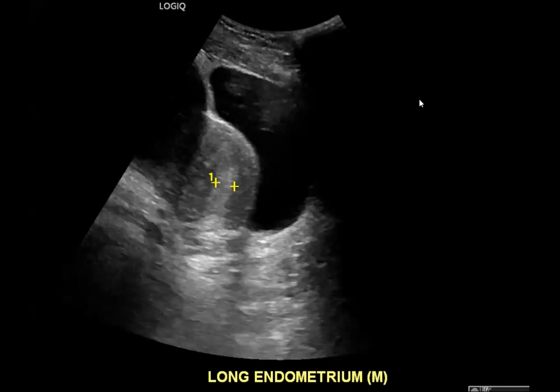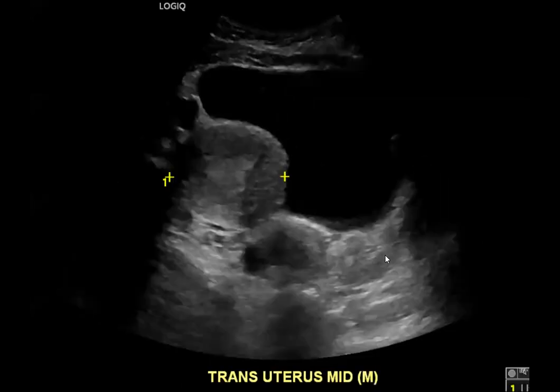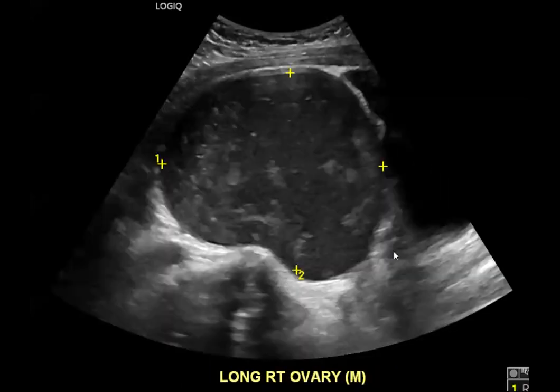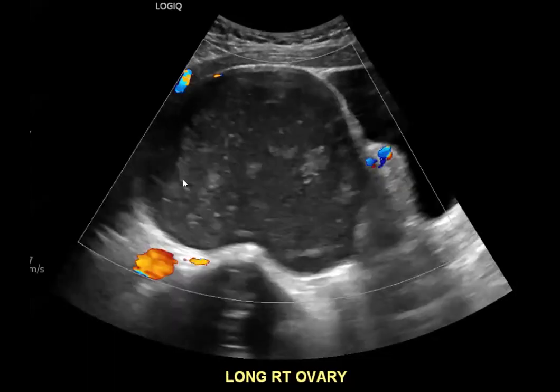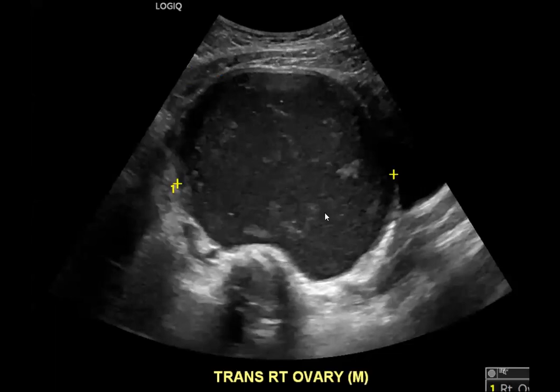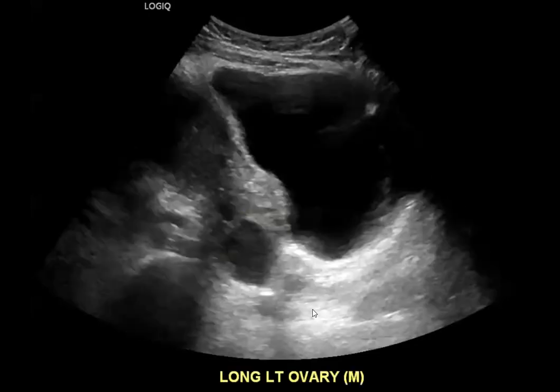So this is a patient with pelvic pain. Their uterus was pretty normal. And then this was the region of the right ovary or right adnexa. So we've got a large mass-like lesion, but it did not seem to have flow within it. Pretty heterogeneous, but also internally has a lot of low-level echoes. So that's the right side.